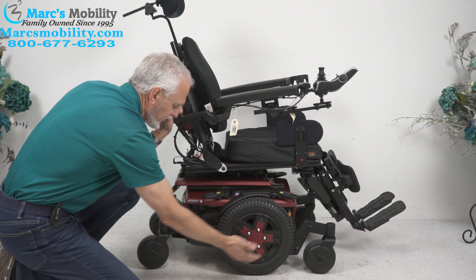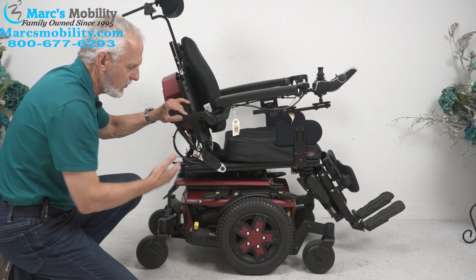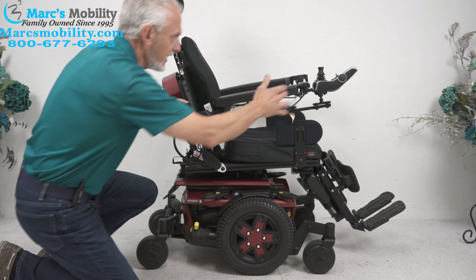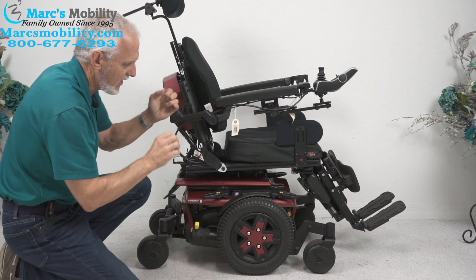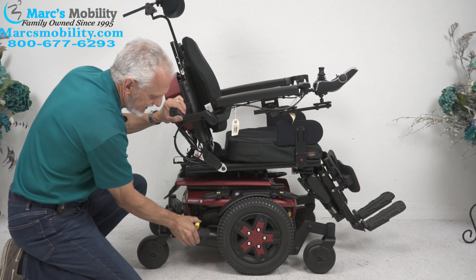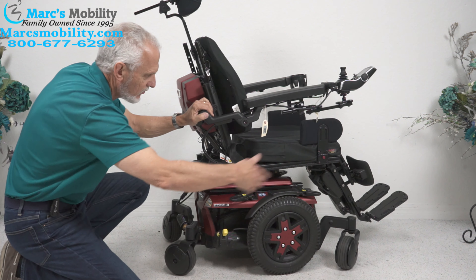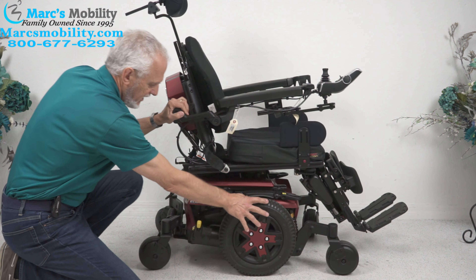There's a motor for each wheel — one here and one on the opposite side. This chair weighs about 350 to 375 pounds, so you're not going to lift it. If it's not working and you need to roll it, it's best with the power off to put it in neutral so you have no resistance. With the power off, push that lever down — it unlocks the wheel. You have to do both motors, then you can roll it around. Push it back and you're in gear.